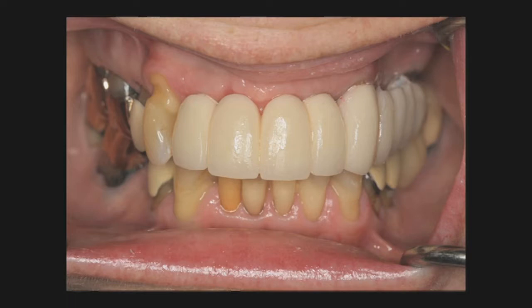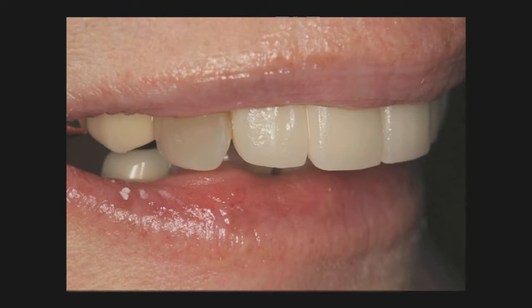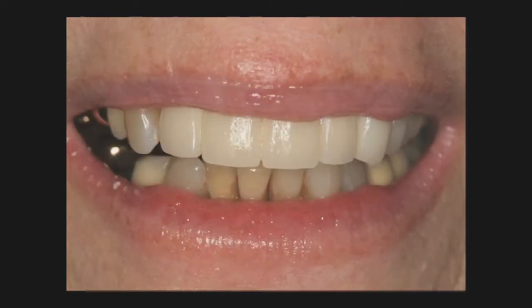I knew the aesthetics and function of her existing bridge was compromised. This prepared the patient for implants in the future in teeth number 12 and 13 areas, and eventual aesthetic redesign of her maxillary right quadrant. What a motivation we had for this patient to continue her aesthetic reconstruction. And we can see in the following photographs right and left lateral views of the temporary prosthesis placed immediately at the time of surgical intervention.